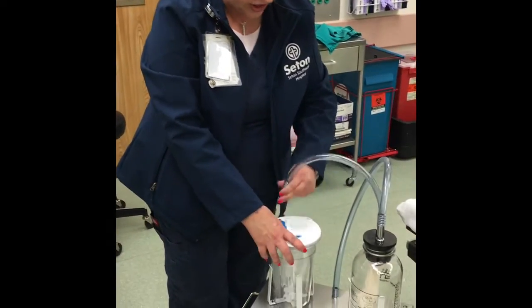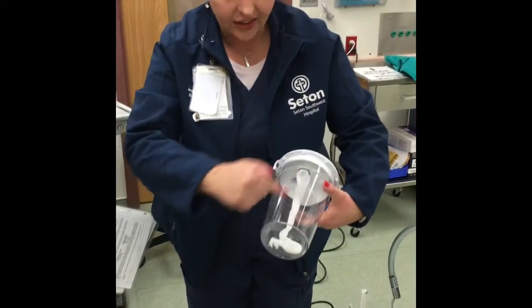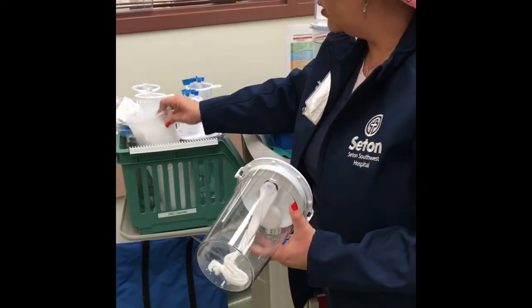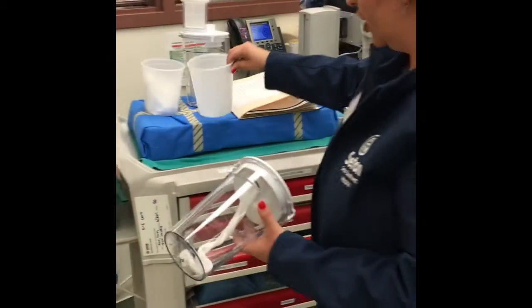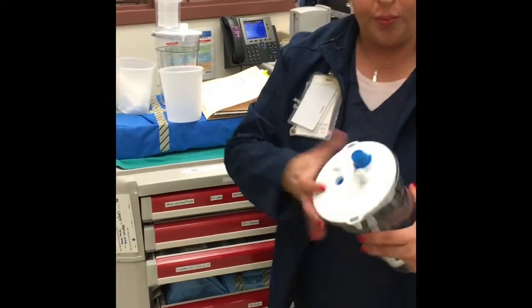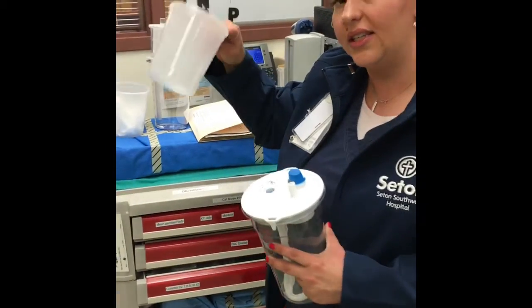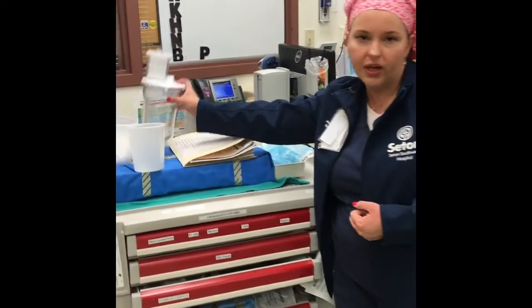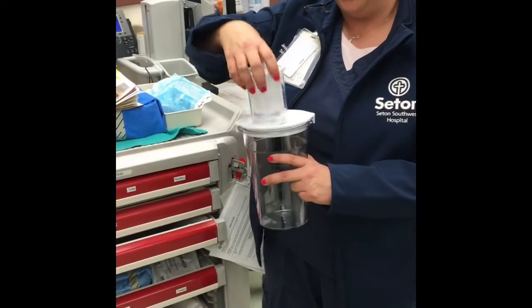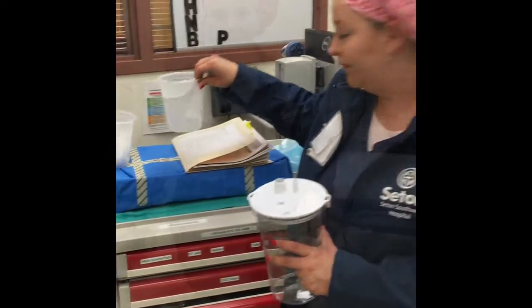After you're done with the procedure, what you would do if you had done a D&E is take out this inside specimen sack, and it'll go in a container such as this that's on your cart. So you would open this up by pulling this off, take that out and put it in here and send this to pathology. If you're utilizing the other canister that's most commonly used, all you have to do is take this out, place it in there, put a lid on it, and label it.